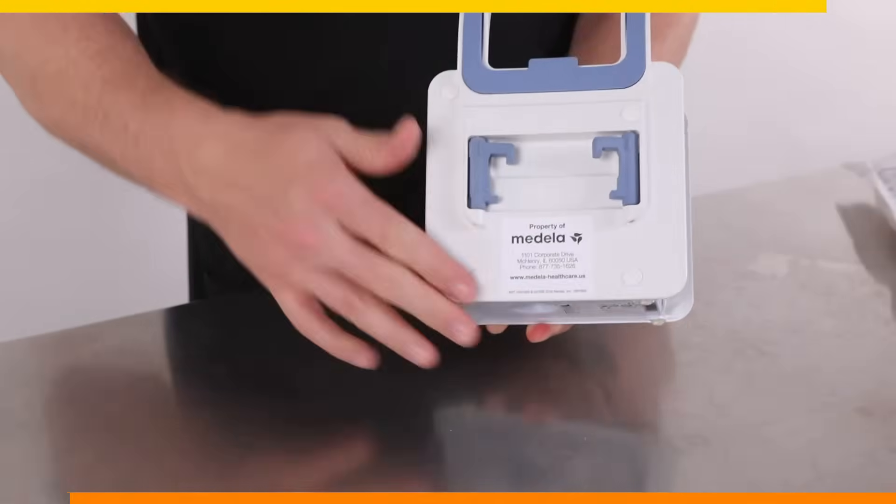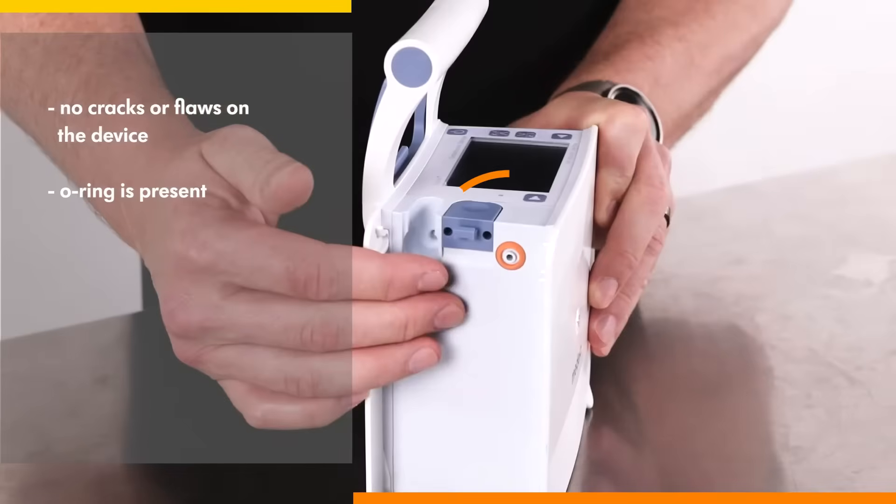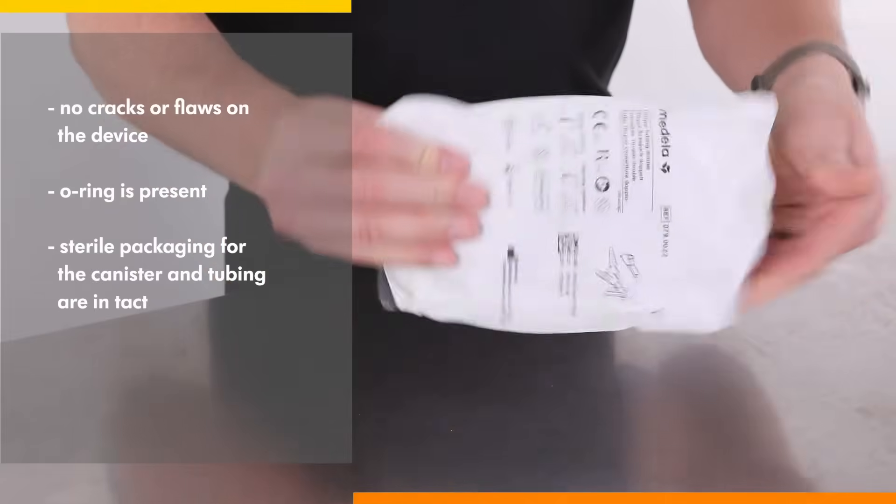Always get into the habit of checking everything first, making sure there are no cracks or flaws on the device, make sure the O-ring is present, and make sure that the sterile packaging for the canister and tubing are intact.